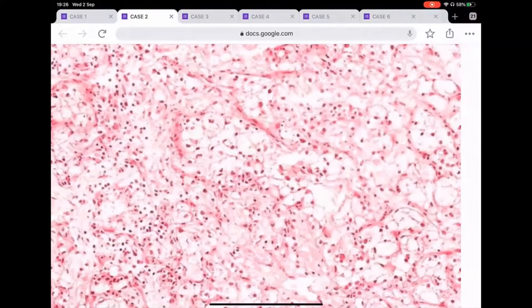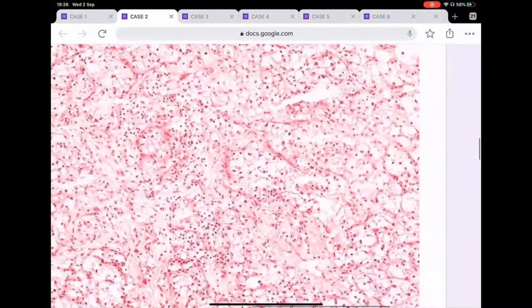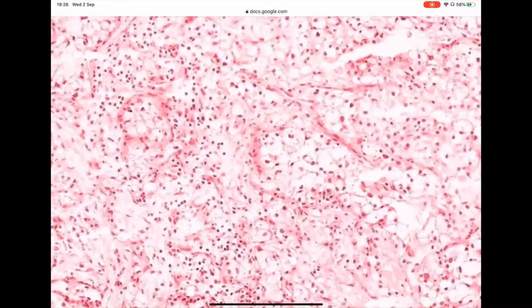stamp answers. You know, they tell you if you see an eosinophilic tumor, put this answer. If you see a clear cell tumor, put these answers. There's no one rule that works for all, and if you are one of those pathologists who put stamp answers for every question based on the characteristic, clear cell, spindle cell, small round blue cell, whatever, then there is a problem, because there are scenarios, like this scenario in front of you, where this is a clear cell carcinoma. There is no need to argue the case more because we see the nests, we see the clear cells.